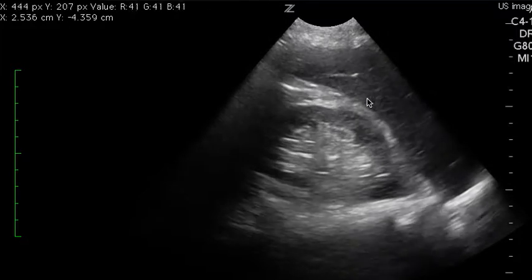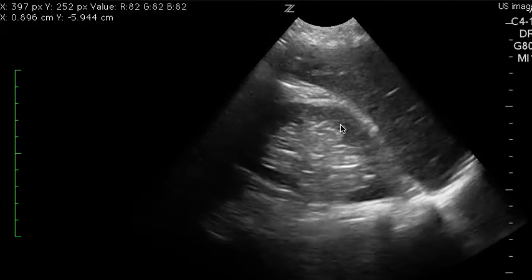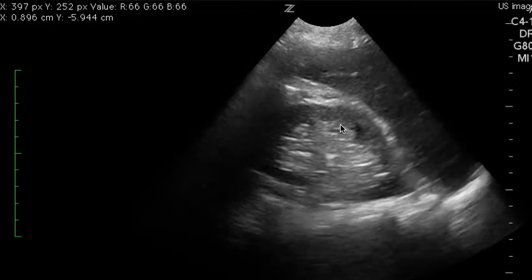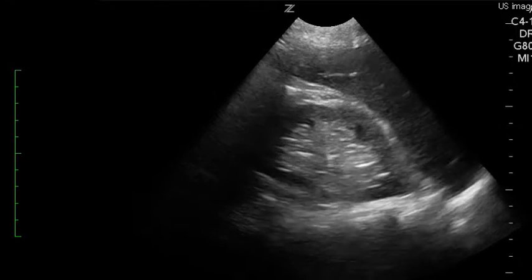A second thing I want you to take from this is that you need to either move the probe anteriorly and posteriorly, or you need a fan. I need to be able to see the entire three-dimensional structure because though you don't see any free fluid here, there may be areas where you do, and so that's one thing to be very careful with.